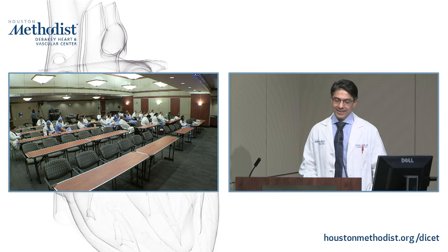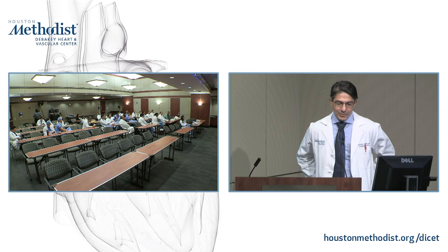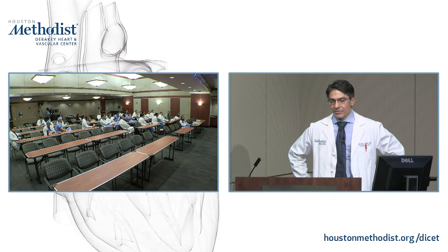So my question is, when that happens, usually what are the most common sources of problems that make you unhappy? Yes. So Dr. Quinones, what he's hinting at is that CT is an unforgiving technique. I contrast this to MRI. With MRI, you're standing there, you do the image. If there's motion or an arrhythmia, because there's no radiation, you have a chance right then and there to correct your image. With CT, once you've acquired that image, it's unforgiving. You've delivered iodine and you've delivered the radiation.